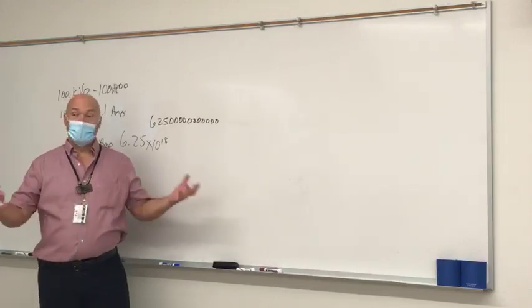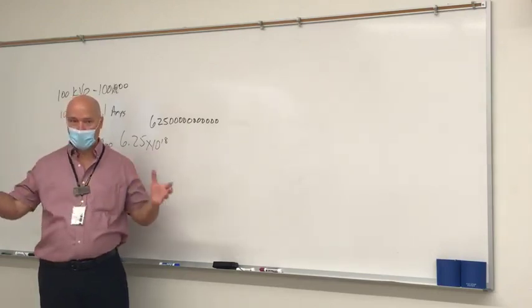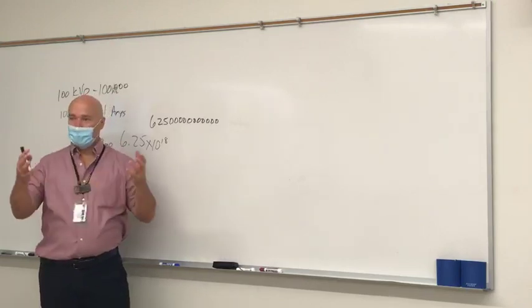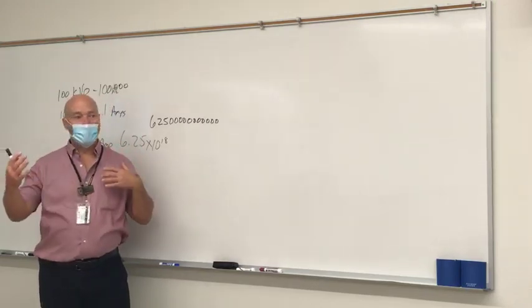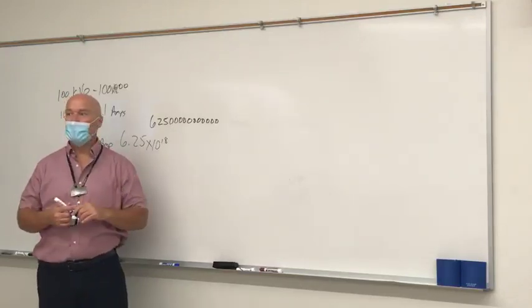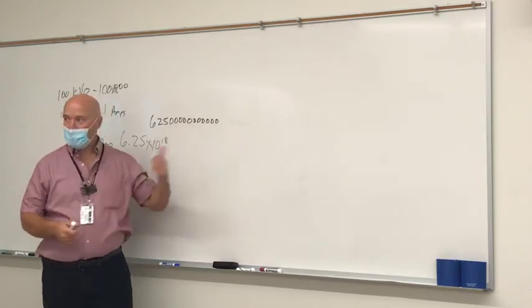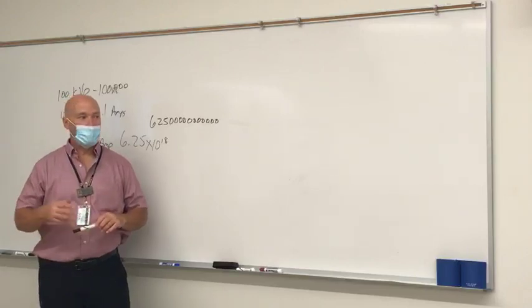Okay, so we're going to take all this stuff and break it down over a 16-week period. We're going to talk about each part of that X-ray circuit system, and we're going to learn how to adjust the voltage and the amperage, so that we can maximize this and create a safer X-ray beam for the patient.